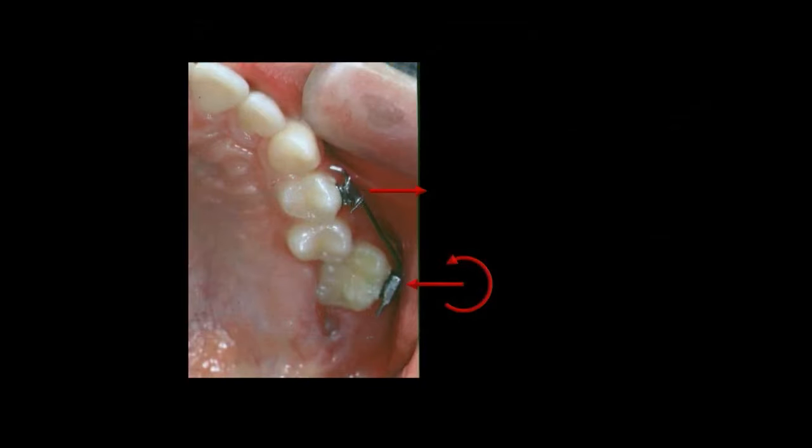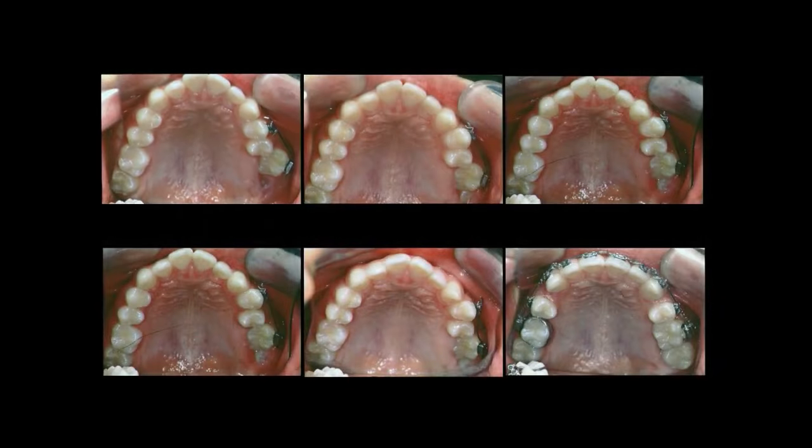Severe rotation of the molar is corrected using a cantilever spring pitted against the first premolar, which is to be extracted later. After proper rotation and lingual movement of the molar was produced, the first bicuspid was extracted, and symmetric space closure was performed in the usual manner.